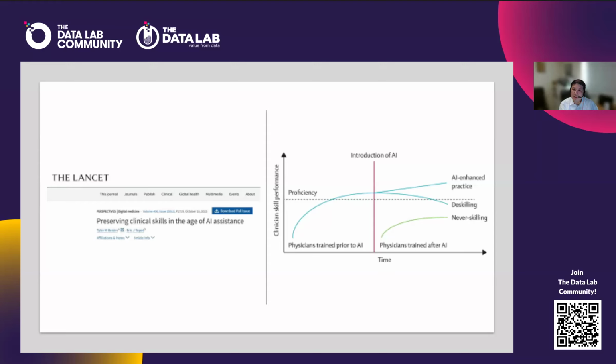The Gemini study that we did had quite a good number of false positives, but because I was experienced, I was able to say, actually, of say the 1,000 cases that you flagged up, I'm only going to call back 50, which is what we did. And of those 50, we found another 10 or 11 cancers from that group. But that requires settled knowledge that's within.